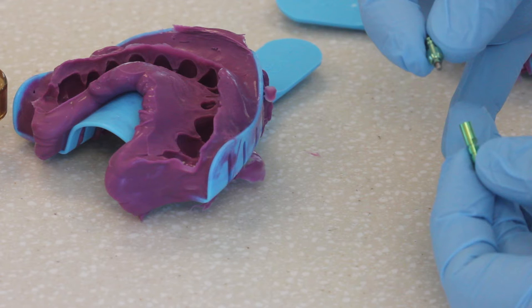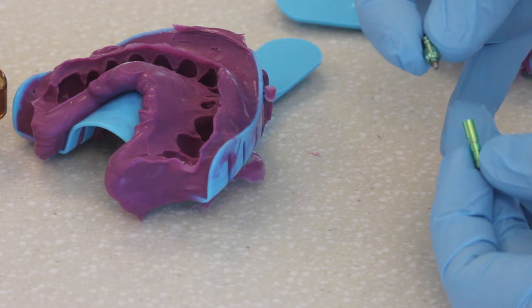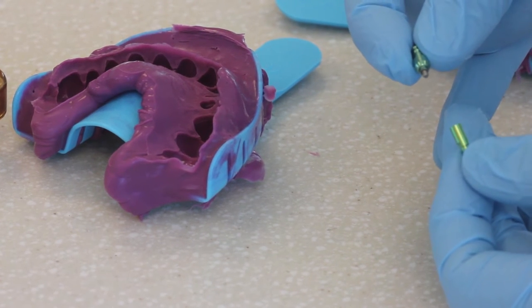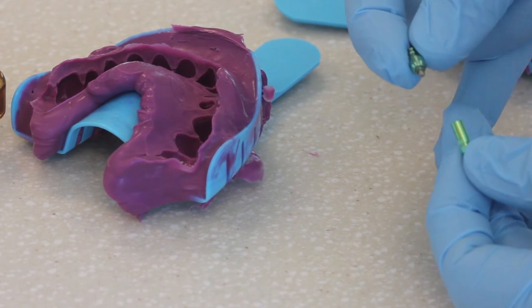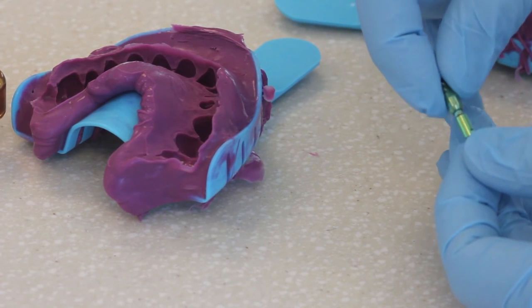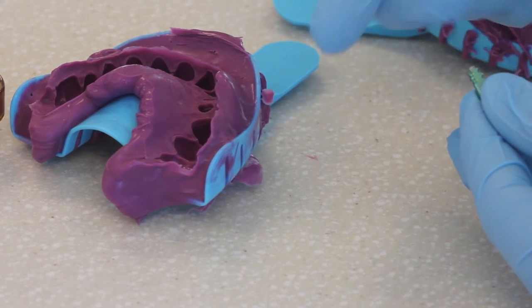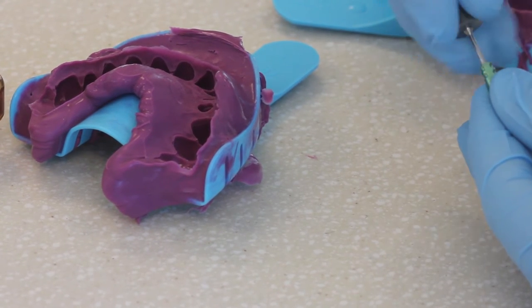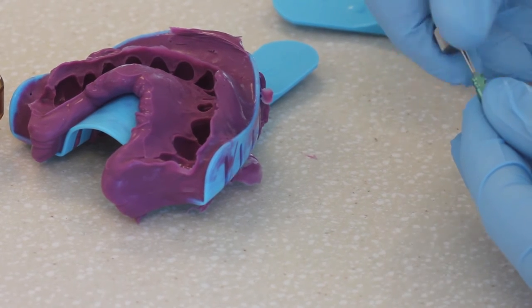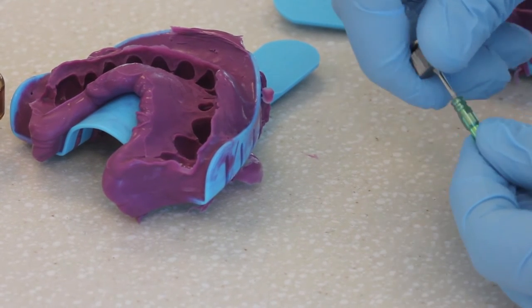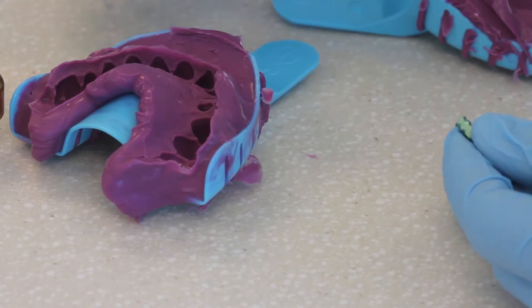You're also going to unscrew the impression coping from the implant and replace the healing abutment. At this stage, once everything is out of the mouth, you want to reattach the impression coping onto the implant analog. Remember, the implant analog is intended to mimic the implant in our master cast. Tighten that together.